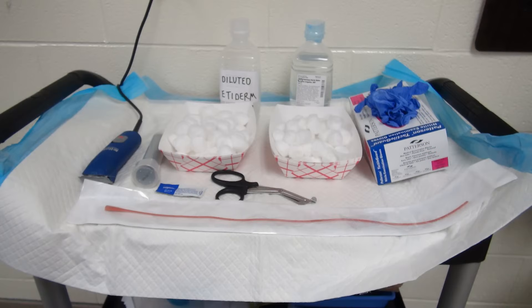Supplies needed for the lab include clean cotton balls, some soaked with diluted Etiderm soap solution, and others with sterile water. We have way too many cotton balls in these trays.